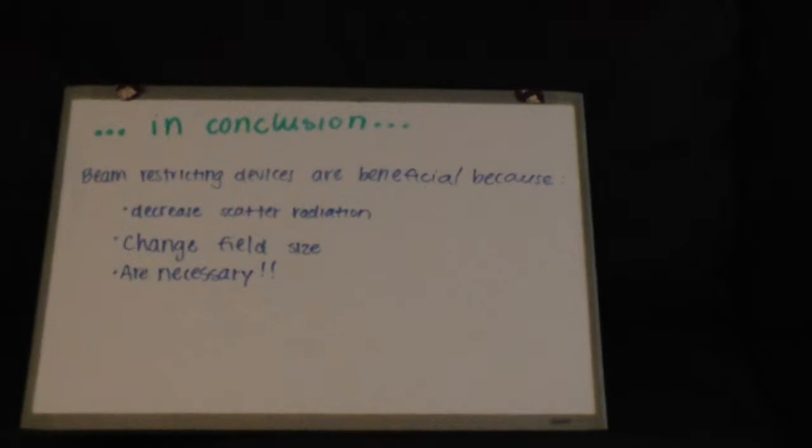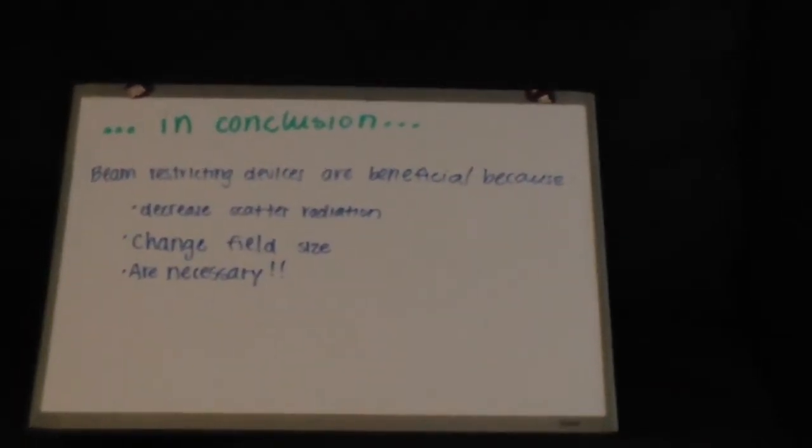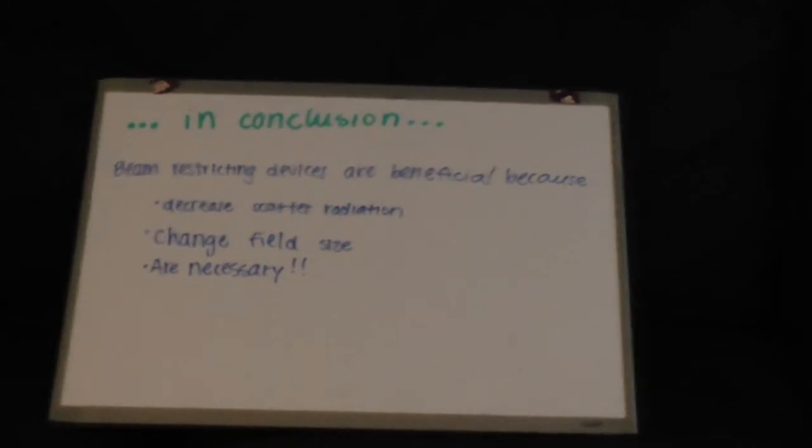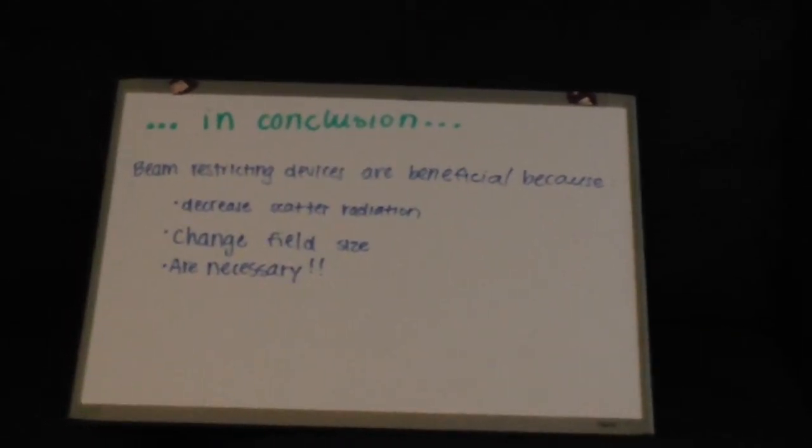In conclusion, beam restricting devices are beneficial because they decrease scatter radiation, they change the field size, and are necessary in the X-ray technician world.